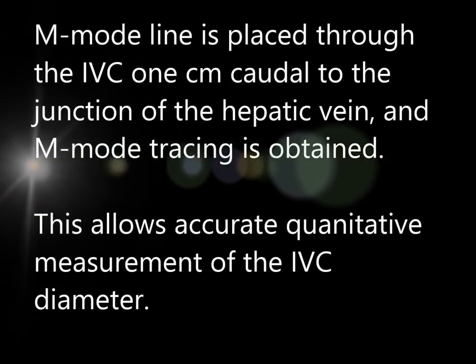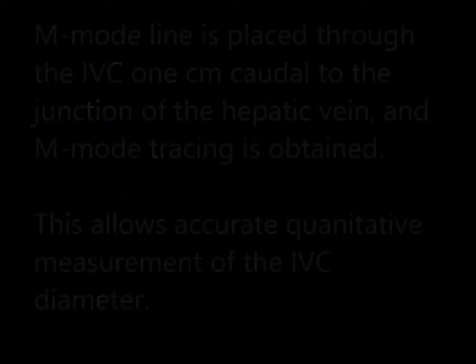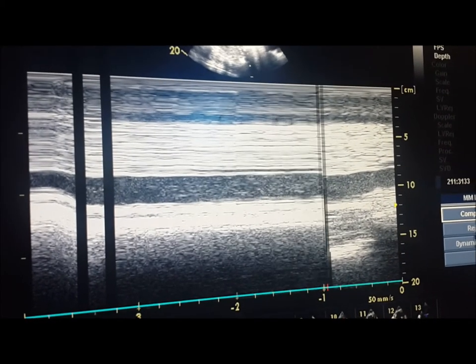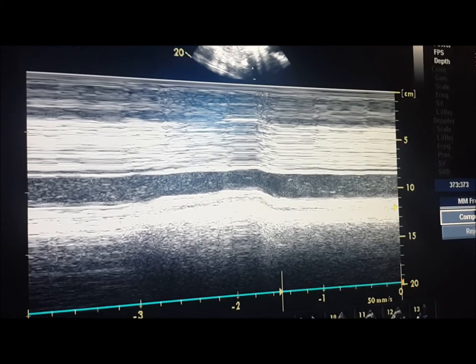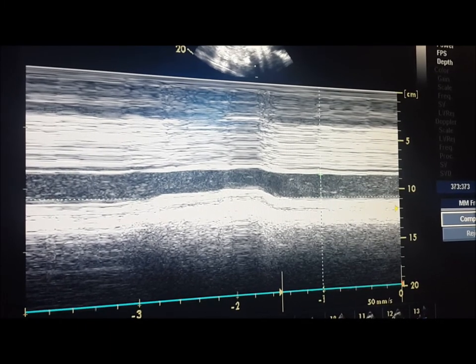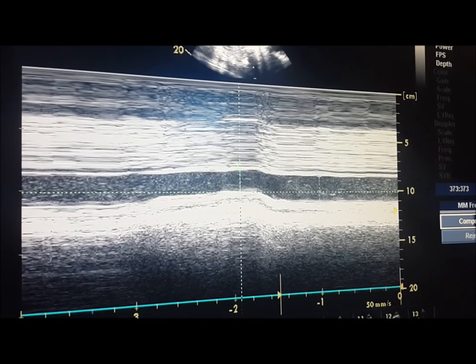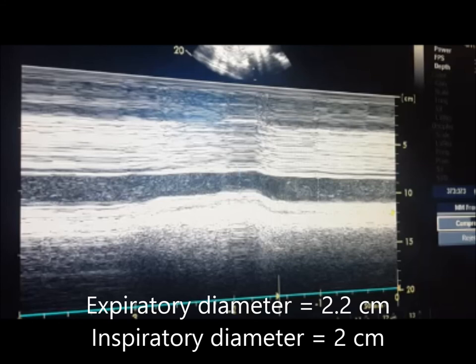Now let us place the M-mode line through the IVC 1 cm caudal to the junction of the hepatic vein and obtain M-mode tracing. This allows accurate quantitative measurement of the IVC diameter. The image is now frozen and measurements of the IVC diameter are performed both in expiration and in inspiration. The measurements are shown to be 2.2 cm for expiratory diameter and 2.0 cm for inspiratory diameter.